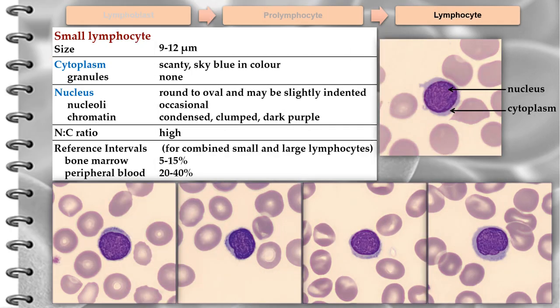The small lymphocyte varies in diameter from 9 to 12 micrometers. The cytoplasm is scanty, sky blue in color, and non-granular. The nucleus is round and occupies about 90% of the cell area. The chromatin is condensed, staining a dark purple. Nucleoli, although always present, are rarely visible with the light microscope. Usually the nucleus is about the size of an erythrocyte.